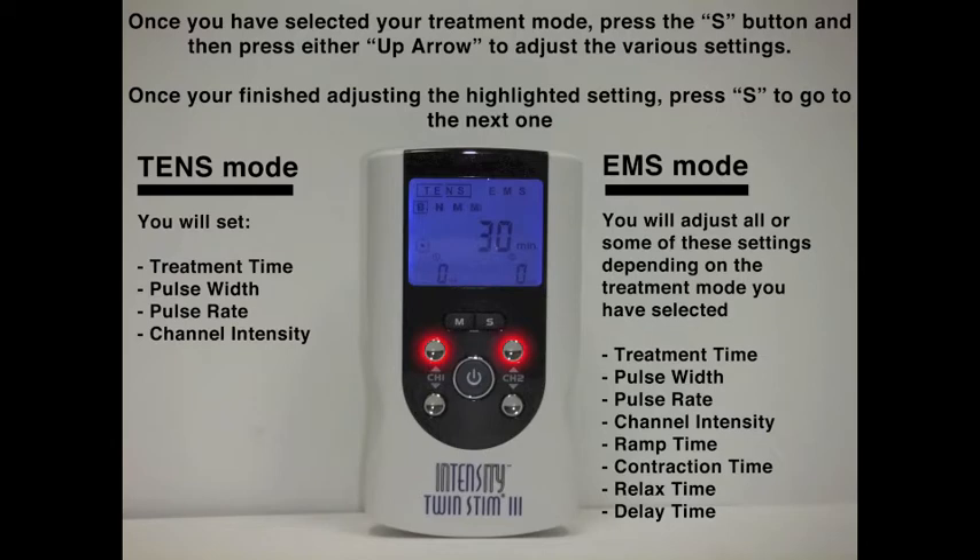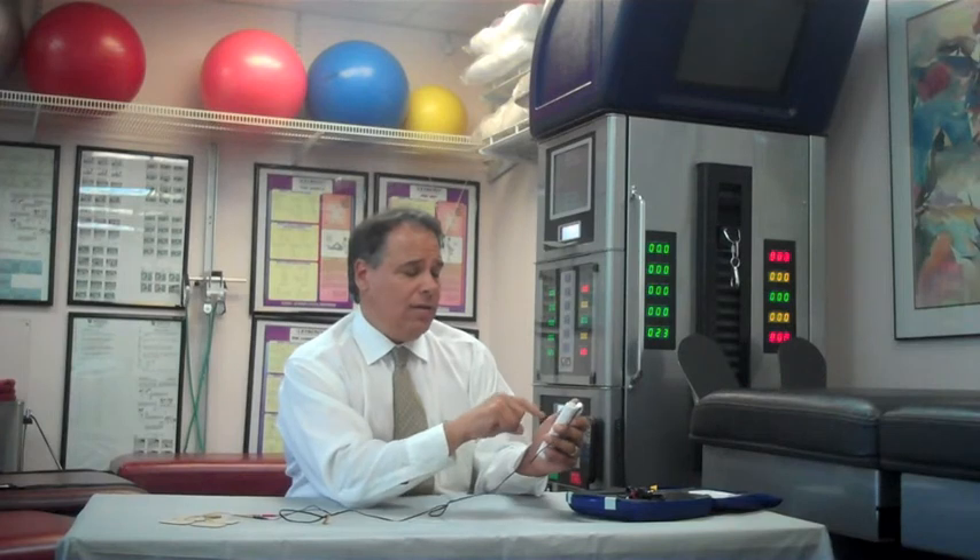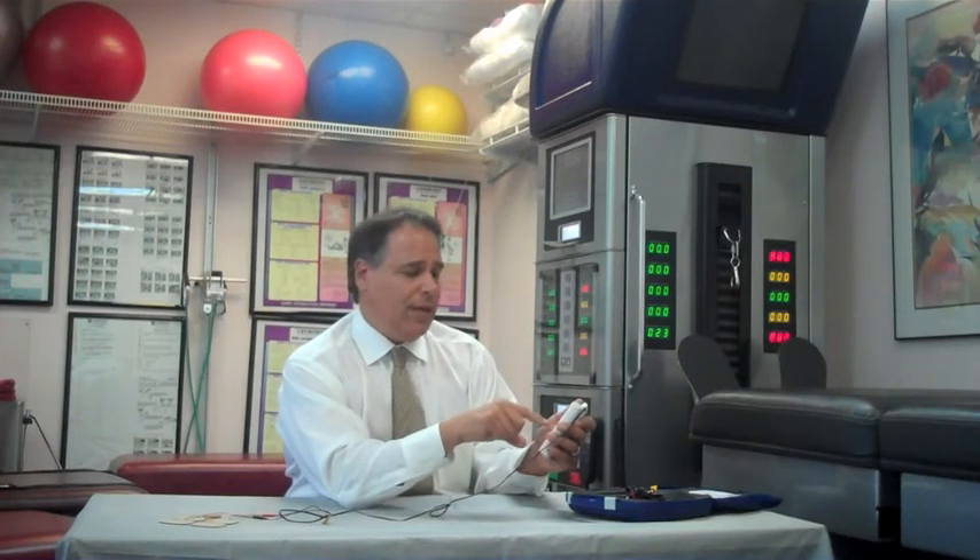Press S again and PR for pulse rate will display. Again, you can use the up and down arrow. Press S one more time and we can begin increasing intensity with the up arrow. You want to just begin at a comfortable level and then you may increase. You will also notice that after a short period of time — 30 seconds — a little key will display, and that will prevent you from accidentally increasing the intensity. In order to adjust that, you would press the down arrow one time, and then you'll be able to increase your intensity.